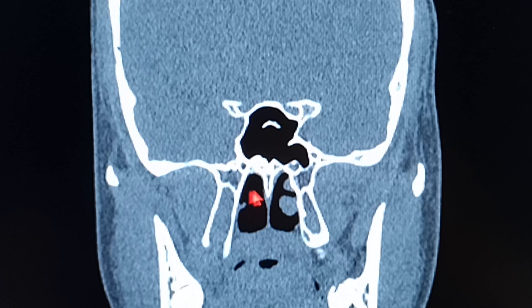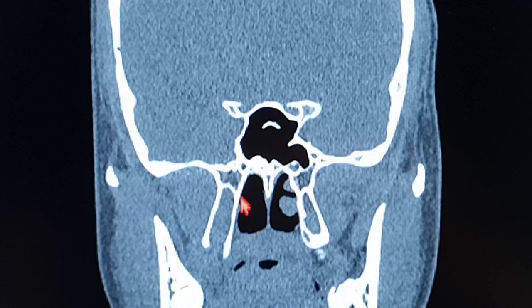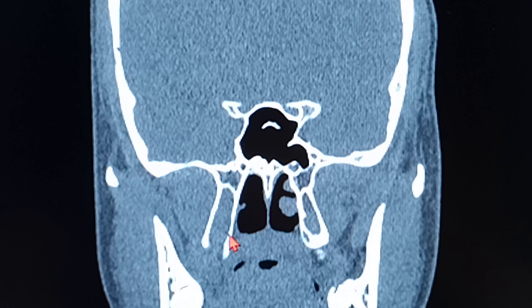So if you have a choanal atresia, you have to see whether that is a bony atresia or a cartilaginous, or you can say a membranous atresia. If it's a membranous atresia, it's okay. But if it's a bony atresia, you have to drill this entire bone, which could be coming from the medial pterygoid plate or the extension of the medial pterygoid plate. You can make a common posterior opening by doing a septectomy, and you make a mini Haddad flap, split that flap in two, and then you can just reposition and cover the bony raw area and have a good wider opening behind. That is how you basically repair cases of choanal atresia on one side and both sides as well.